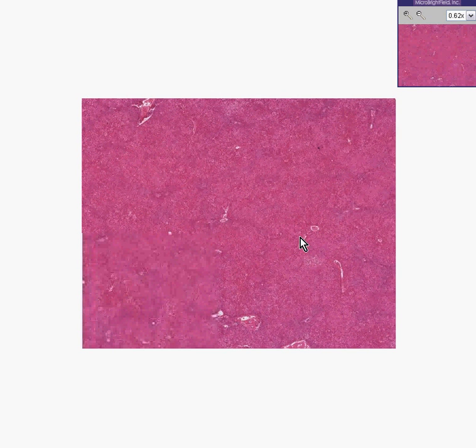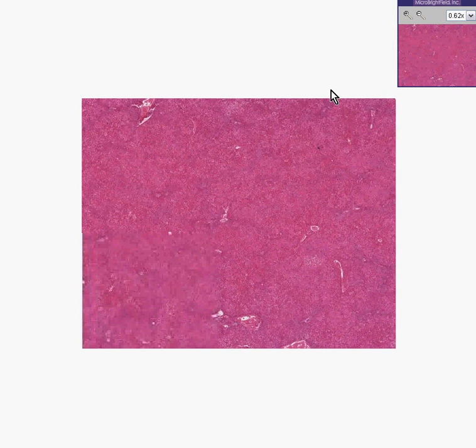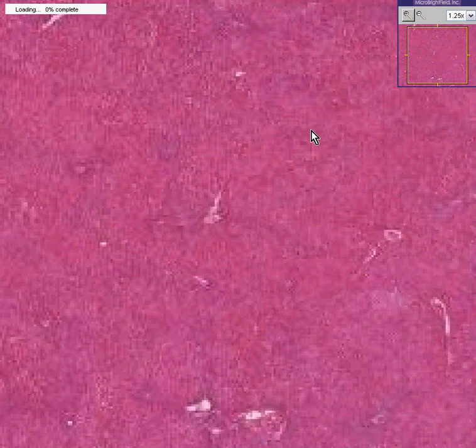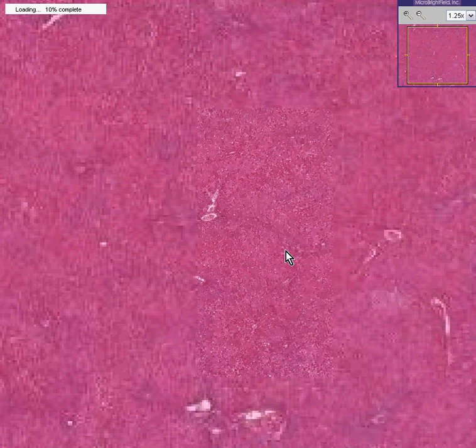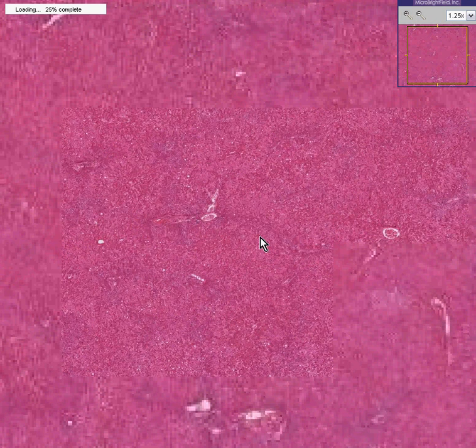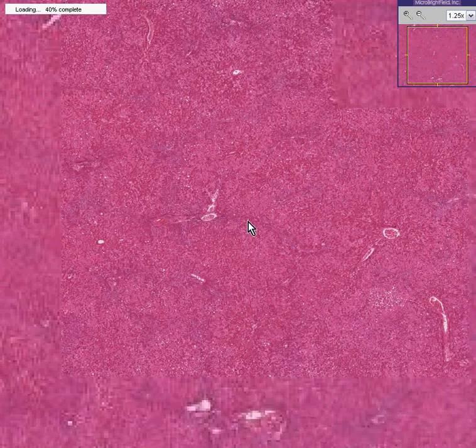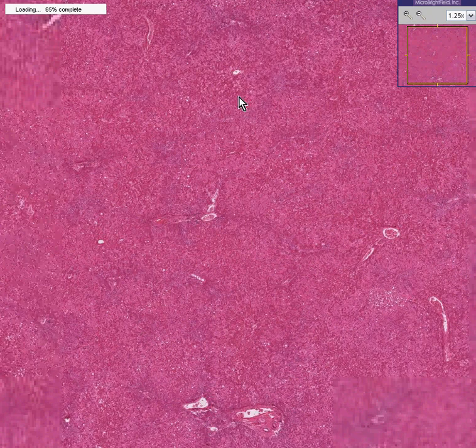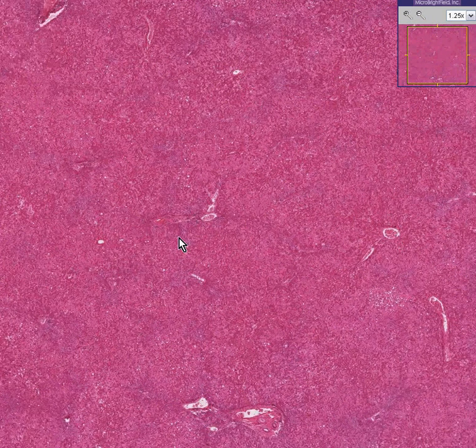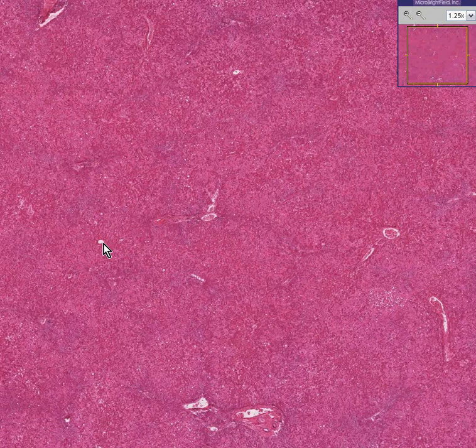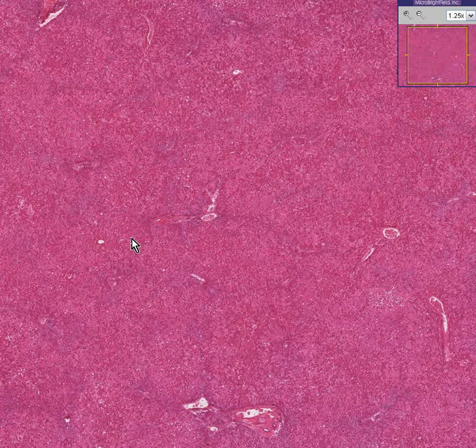And microscopically, I think we are all so smart by now that we can recognize the fact that we have central veins, like here and here and here, because they are vascular spaces which are not surrounded by any type of connective tissue.